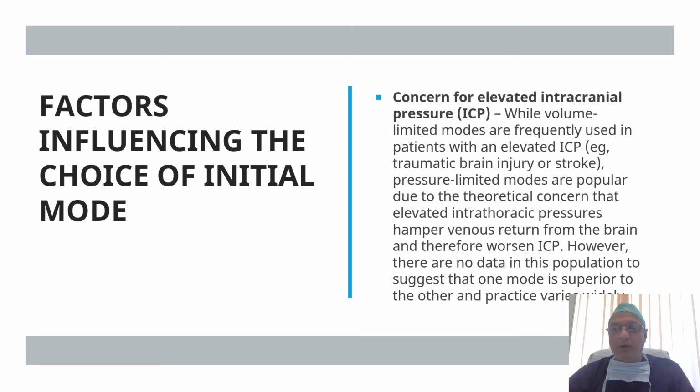There is another area of concern: those patients with elevated intracranial pressure, and what are the evidences which support one mode over the other. While volume limited modes are frequently used in patients with elevated ICP, pressure limited modes are popular due to the theoretical concern that elevated intrathoracic pressure hampers venous return and therefore worsens intracranial pressure. However, there are no data in this population to suggest that one mode is superior to the other.